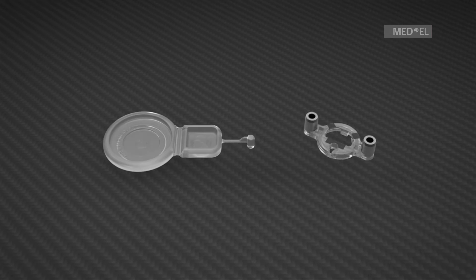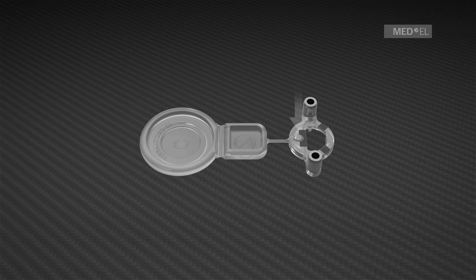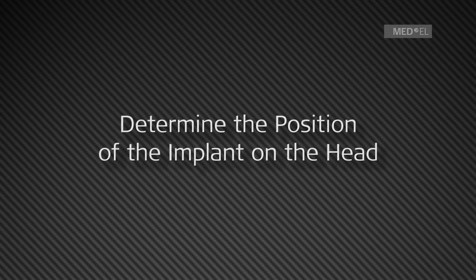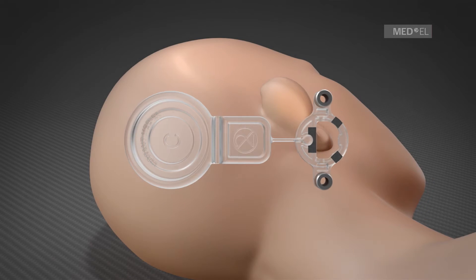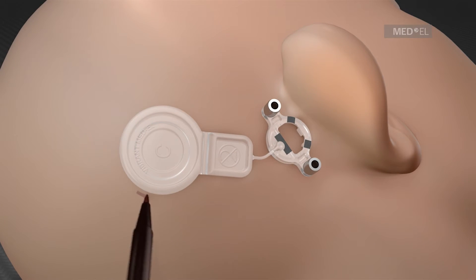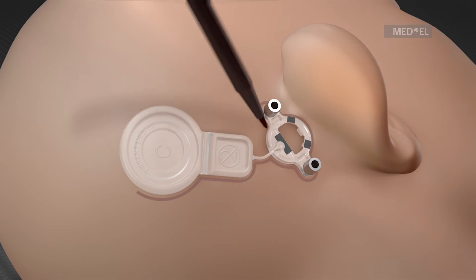The flat transducer sizer and the coil sizer are connected as shown. Using the assembled sizers, the position of the implant on the skin is determined before the incision is made.